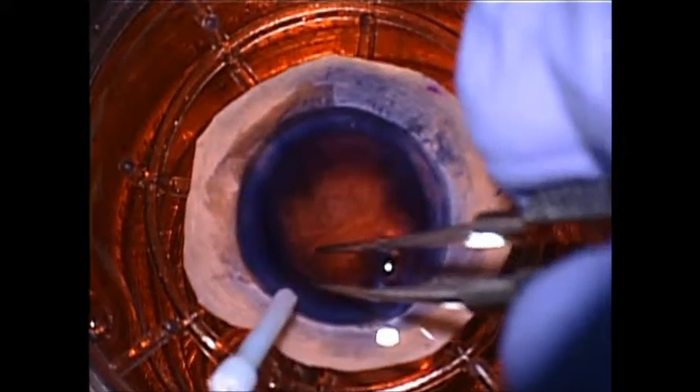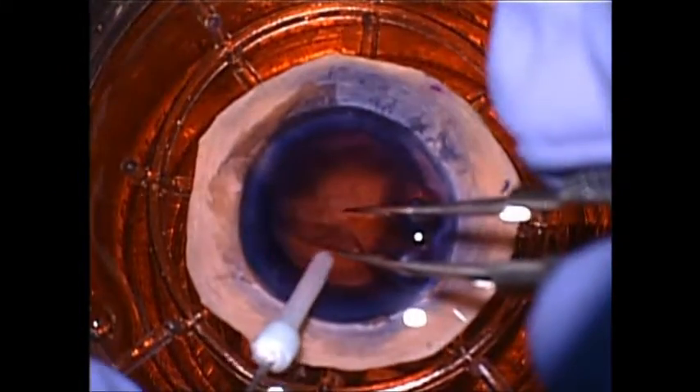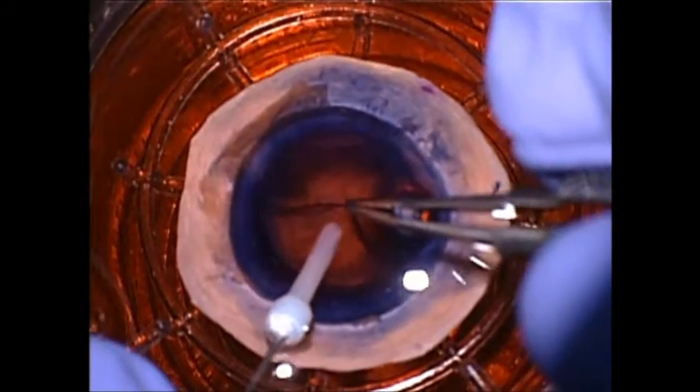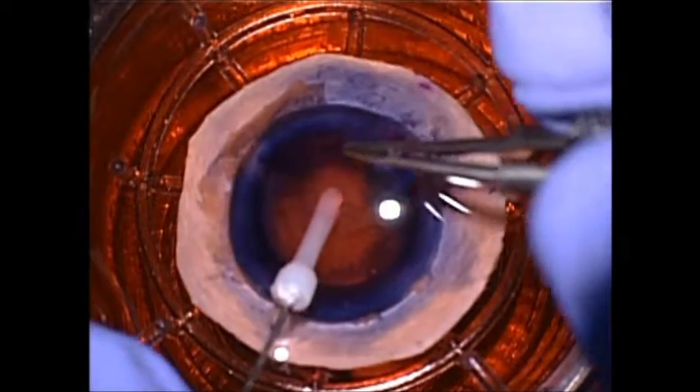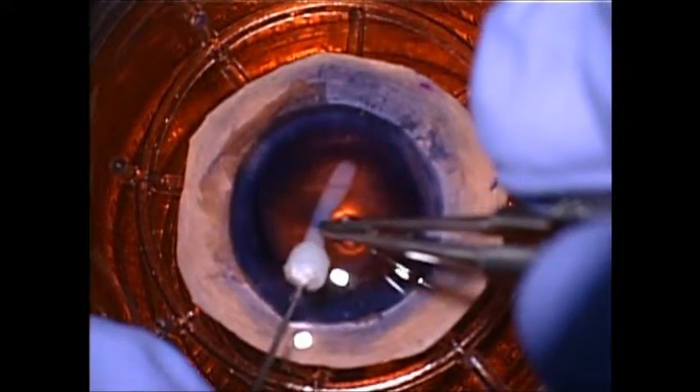We typically prepare the tissue using a SCUBA technique. The final stripping of the tissue is performed while submerged — it is pulled free and away from the donor stroma in a controlled manner, and the inner cylinder is placed between the separated stroma and the graft.